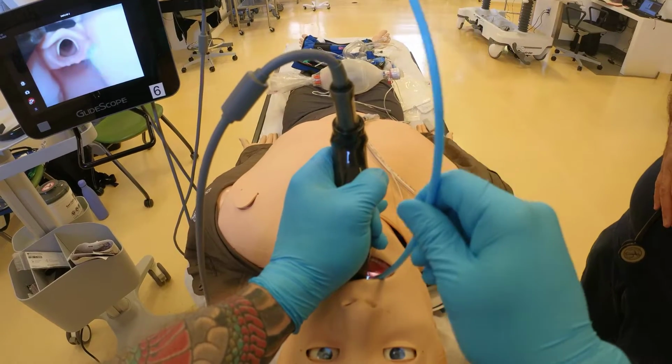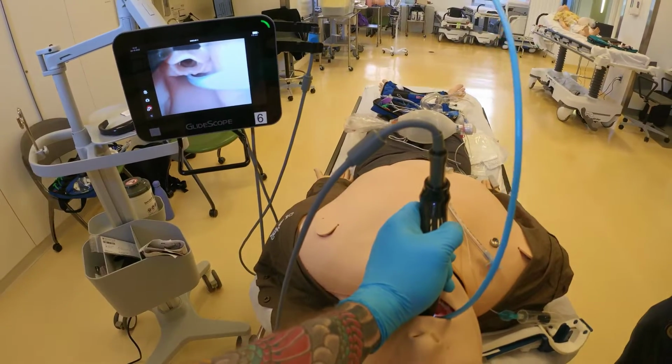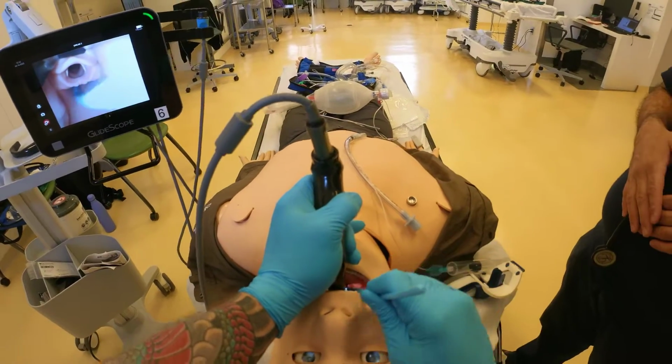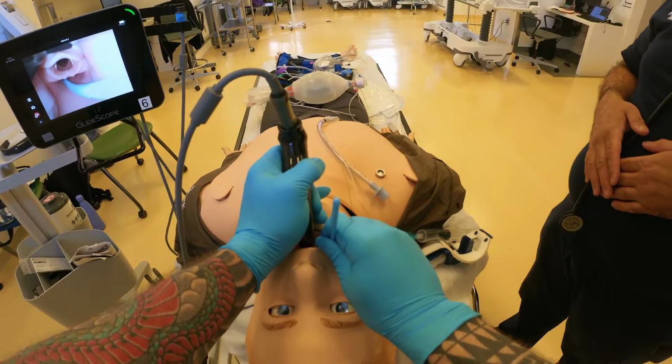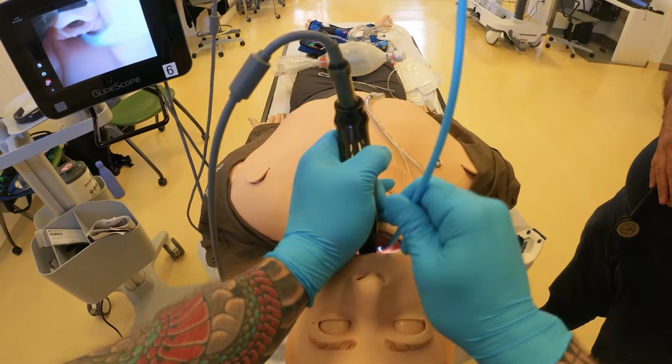Now what I'm going to do is I'm going to specifically put it in the esophagus. So it went into the esophagus space, right, esophageal space. Look, and I keep going, right? And I could bury this into the mannequin. I don't want to do it because I'm going to lose my bougie. But you see how much further I went. So hold up is the best landmark, right?